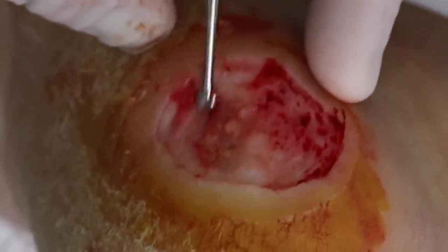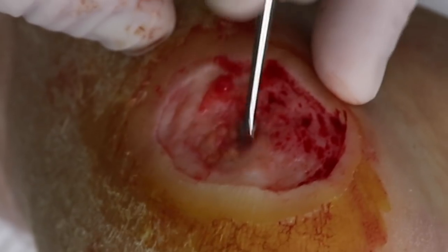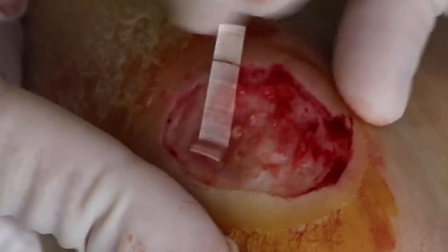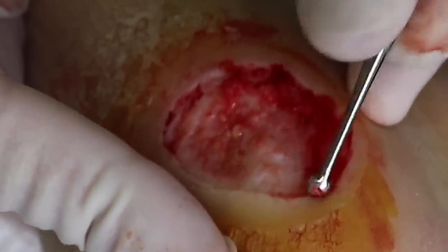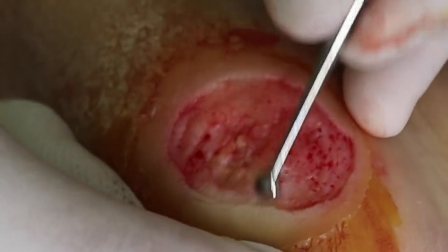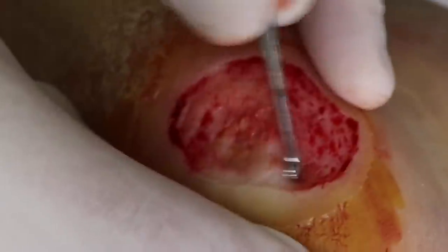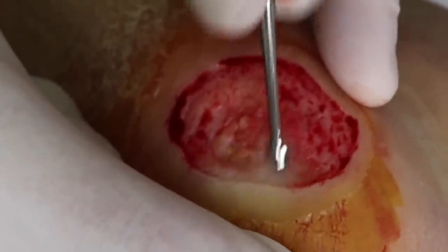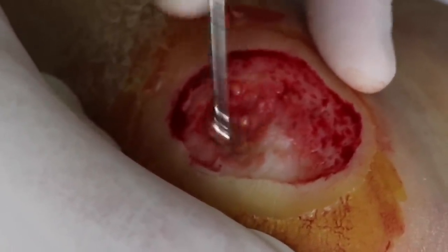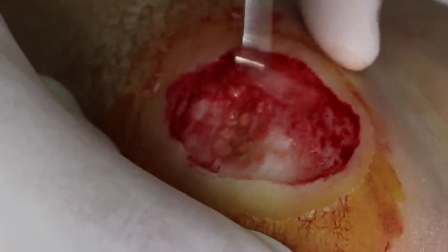So how did you end up here? I literally looked up surgery on a wart and found a video. The rabbit hole! And then how many surgery videos did you watch? Just one — it was kind of disgusting. So how are you gonna feel when you see yours? Probably horrified but I still want to see it. It's just satisfying at the same time. Yeah, we got one really deep pocket but everything's looking good.